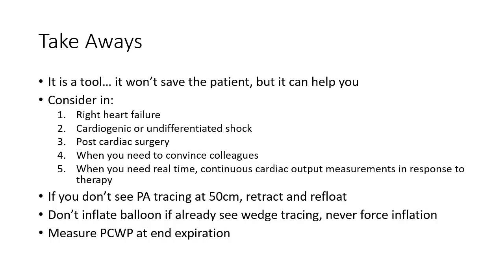And if you don't see a PA tracing at 50 centimeters, remember, retract and refloat to avoid tangling it in the RV and knotting it up. Don't inflate the balloon if you already see a wedge tracing. You could over-wedge and cause the feared complication of PA rupture.